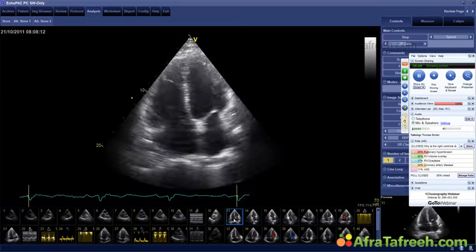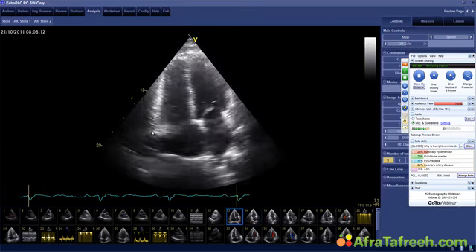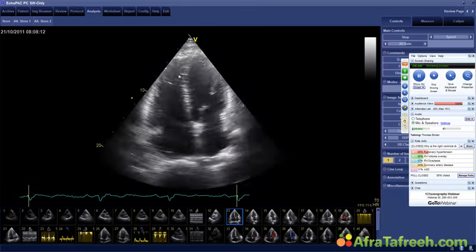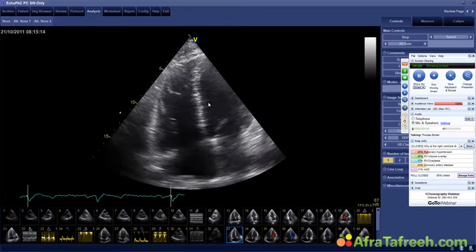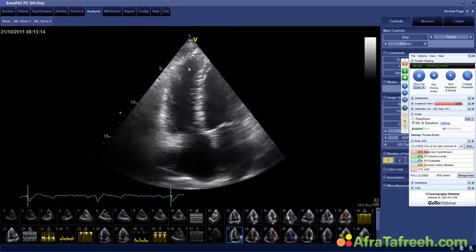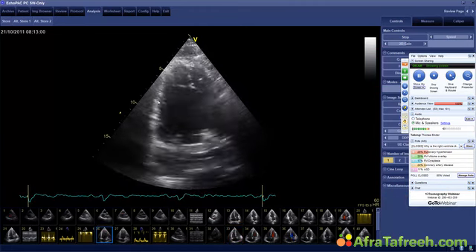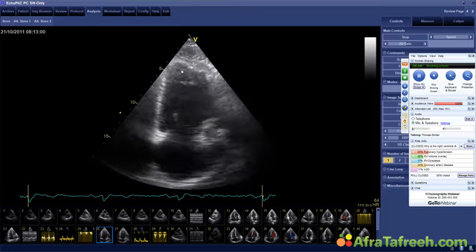And what you see here in this apical 4-chamber view is a right ventricular infarct which also affected the right ventricular free wall and caused a severely reduced right ventricular function. Look at the right ventricle. It hardly moves. It is completely akinetic here. And even if you go to the atypical view that I showed you, where you now would see a different part of the right ventricle, you can see that it's thin and not moving.